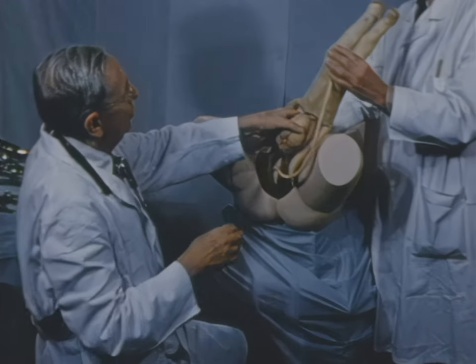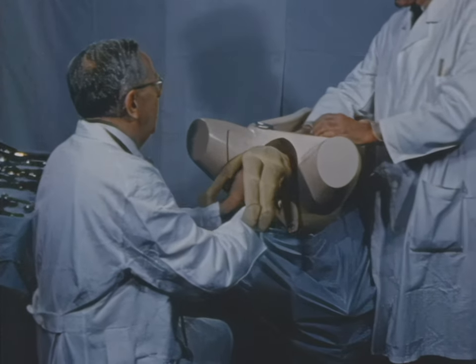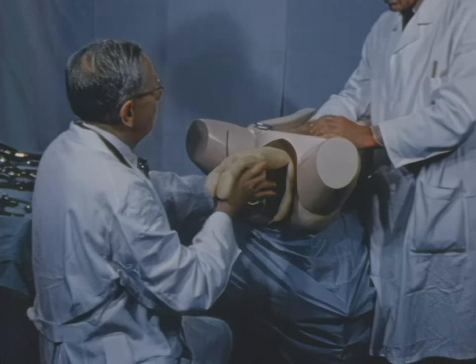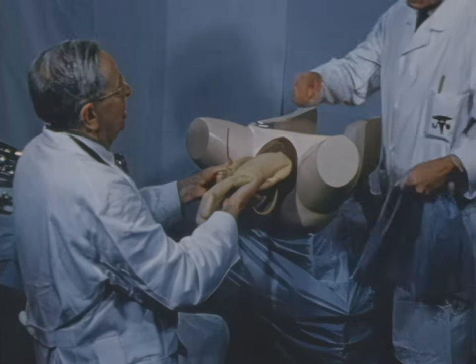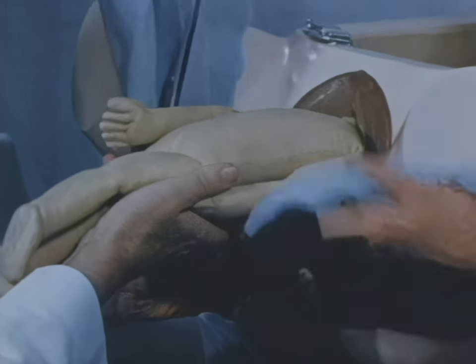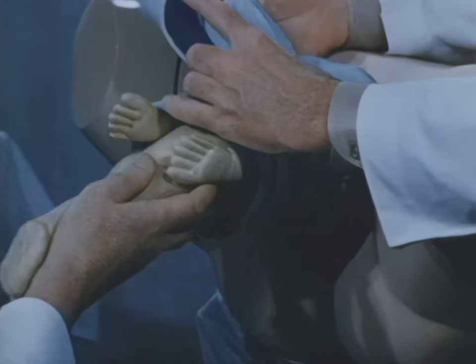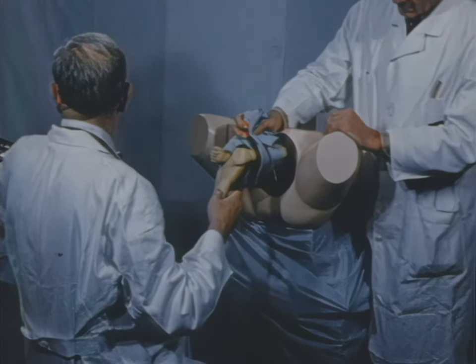There is another maneuver advocated by Savage, which may simplify the handling of the arms, in which a towel is placed around the body, enclosing the arms and keeping them out of the field of operation.